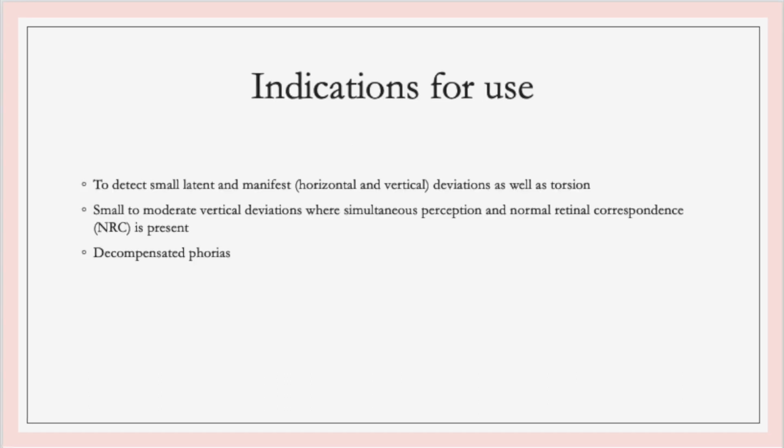Indications for use: to detect small, latent and manifest deviations as well as torsion, small to moderate vertical deviations where simultaneous perception and normal retinal correspondence is present, and decompensated phorias.